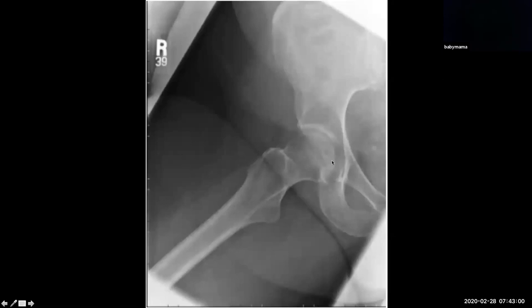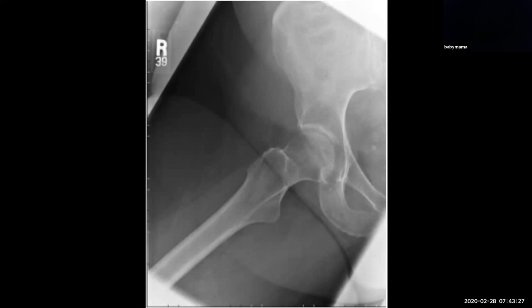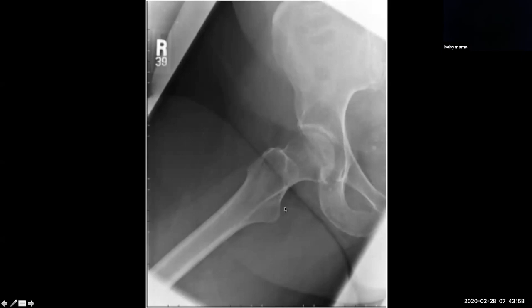Moving on to the frog-leg lateral view of the right hip, we can trace out the rest of our lines. This is the greater trochanter where the gluteus minimus and gluteus medius attach on the anterior and posterior superior facets respectively. Nothing attaches on the posterior facet — the gluteus maximus attaches lower on the proximal and posterior aspect of the proximal femur near the linea aspera. What's profiled at the posterior aspect of the proximal femur is the lesser trochanter, where the iliopsoas tendon inserts.